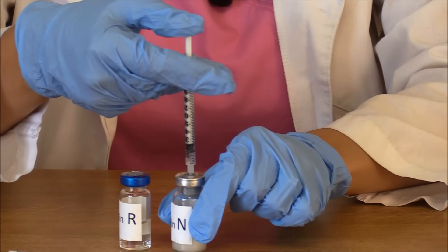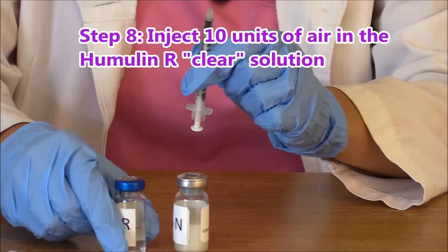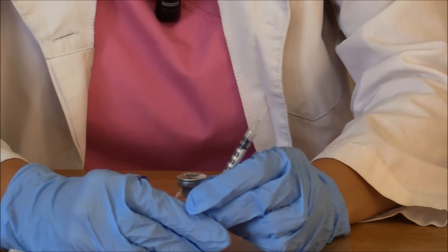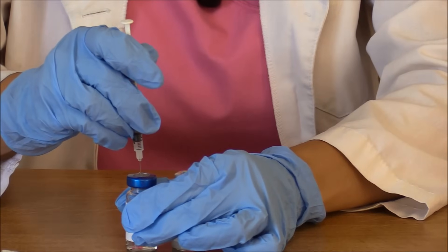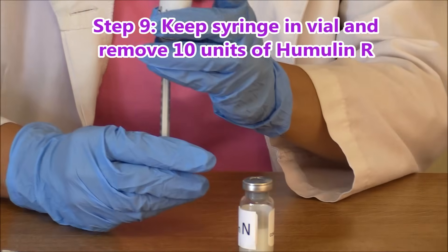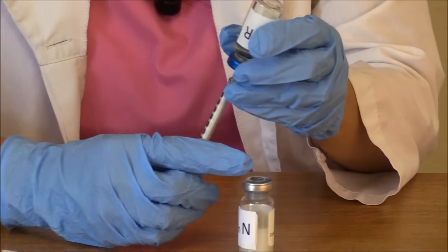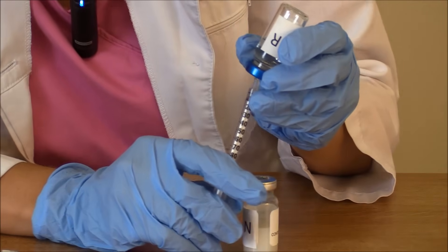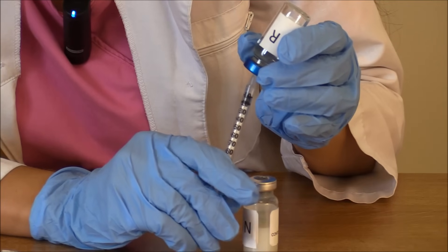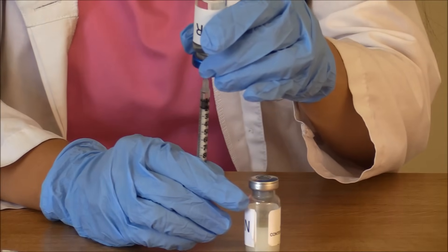Then remove the syringe and inject 10 units of air into the humulin R. Pull back on the plunger to 10 units and do the same thing. But don't remove the syringe — instead, take the bottle and flip it upside down, and remove 10 units of regular insulin. Watch on your syringe where 10 units is and make sure it's precise. Once you have that 10 units, remove the vial.